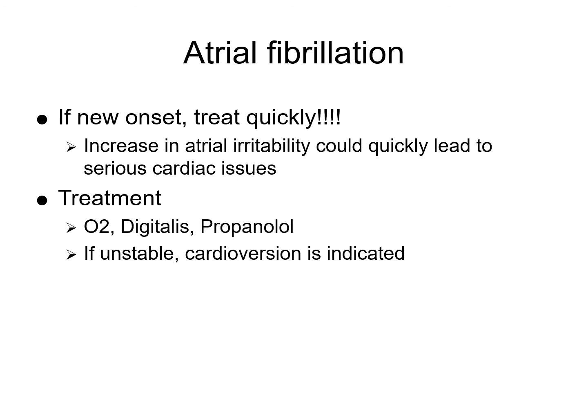So I just want to talk a little bit about monophasic and biphasic, kind of what the difference is. They like to use biphasic generally because you can use it at lower joules. It's considered just as effective as high energy monophasic.